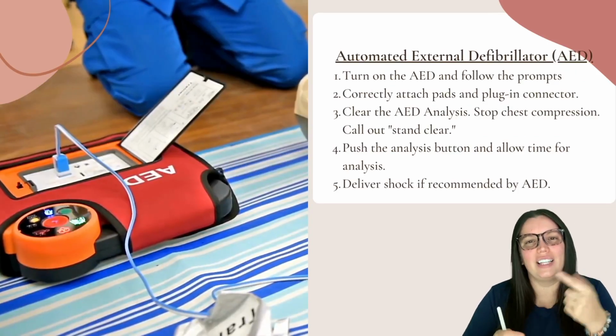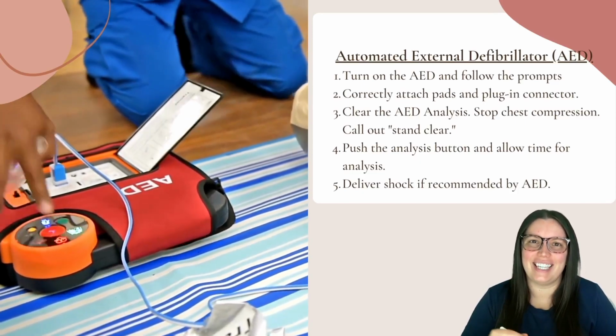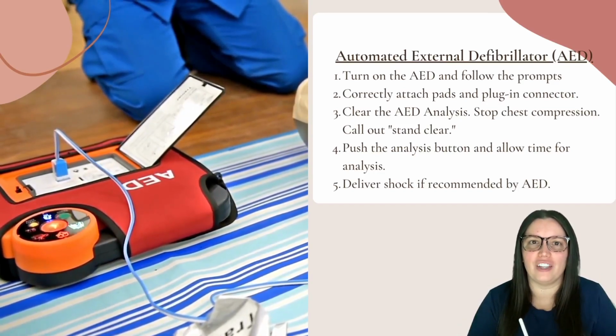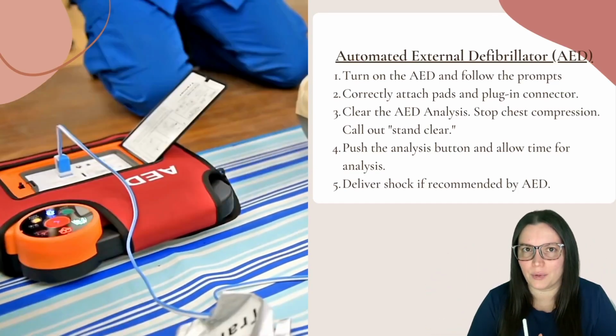So let's talk about our good old-fashioned automated external defibrillator, also known as an AED. That second person, when they arrive as you're doing chest compressions, should be starting to put the pads on those patients. These are the steps that you're going to want to follow when the AED arrives.